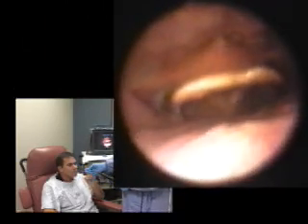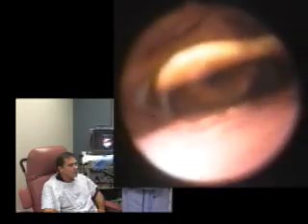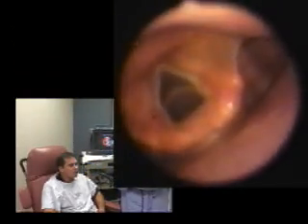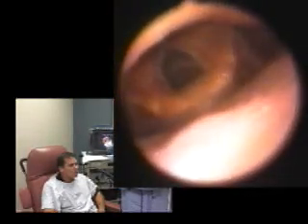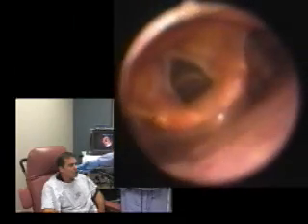Okay, I got it. So we are looking at the epiglottis, as seen here, the vallicular space, the back of the tongue, and of course the glottis is seen down below. If we could get closer to it, Chuck, withhold swallowing. Here we go. Don't swallow, don't swallow. So we have the cords, and we have the arytenoids, and we have the piriform sinus on both sides, posterior pharyngeal wall. And if I hold the scope steady here and ask Chuck to swallow, swallow, Chuck.